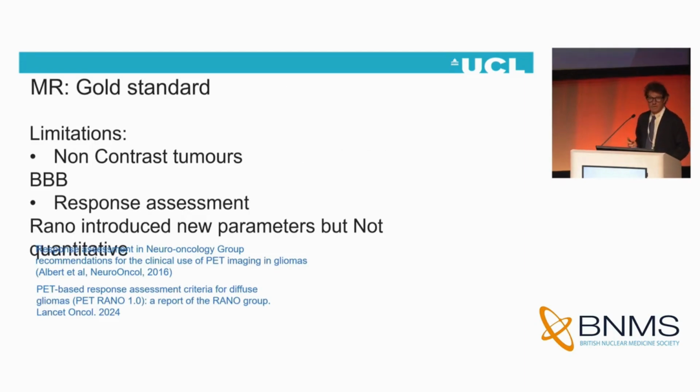Before I move on, let me say what has been already mentioned before. The MRI represents still the gold standard in brain tumor imaging. Nevertheless, there are clearly limitations, in particular in non-contrast tumors, in cases of non-enhancing tumors where there is no disruption of the blood-brain barrier.